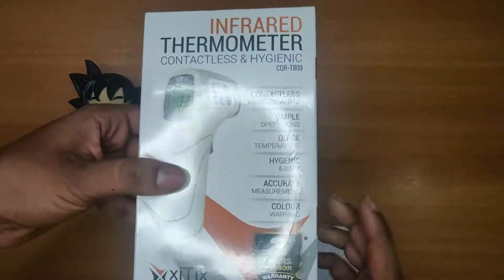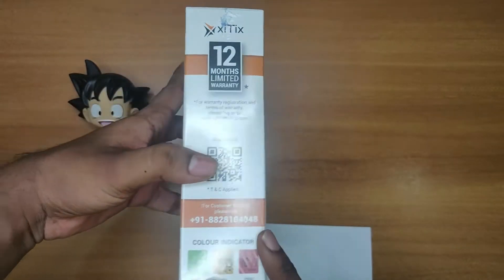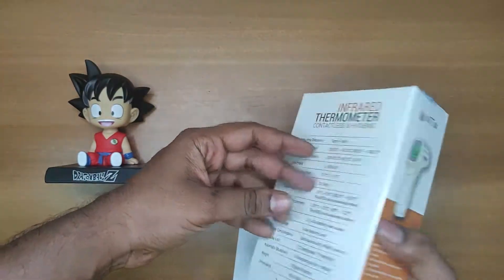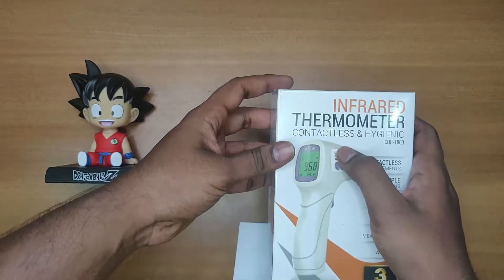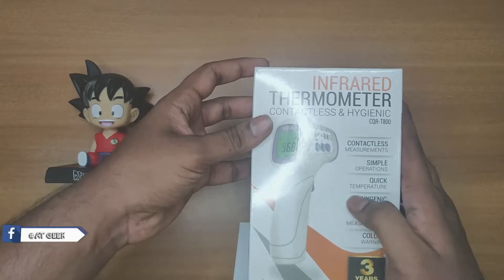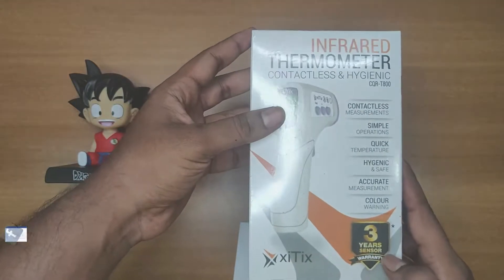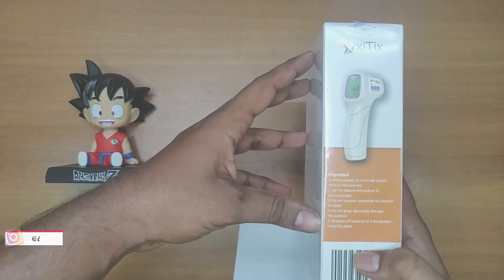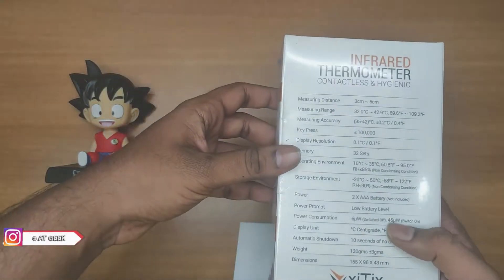As you can see on the packaging, it's written: infrared thermometer, contactless and hygienic, simple operations, quick temperature measurement, hygienic and safe. It also comes with a three-year sensor warranty, and here we got some important tips.